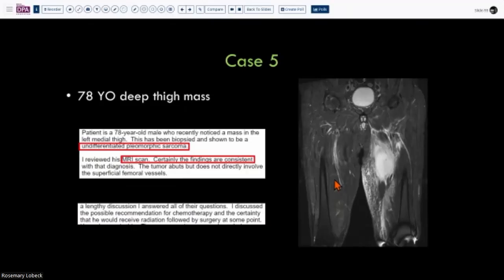Okay, so this case is another green case, so you know what it's going to be. But let's look at the history. This is an older patient this time, a 78-year-old patient with a deeper mass. So there's a deep thigh mass over here, and it's located in the skeletal muscle, and it doesn't have circumscribed borders, right? So it's infiltrative all over. So the first thing you think of, older patient, infiltrative deep mass, is going to be sarcoma. And that's exactly what happened.